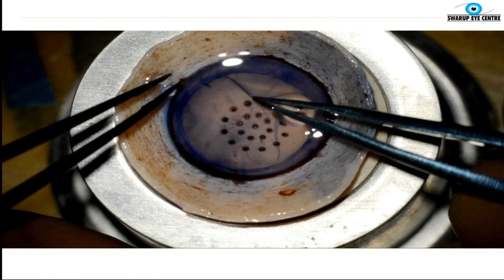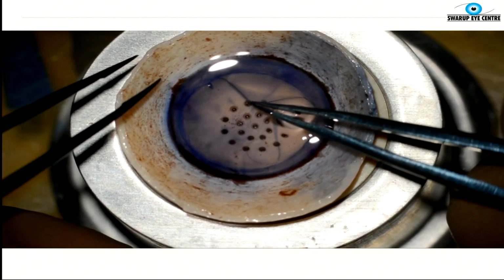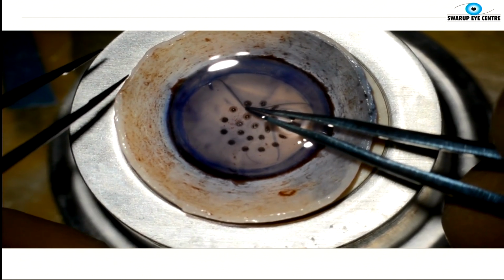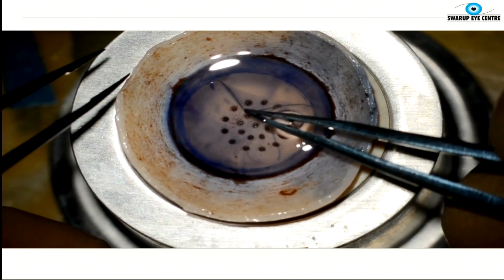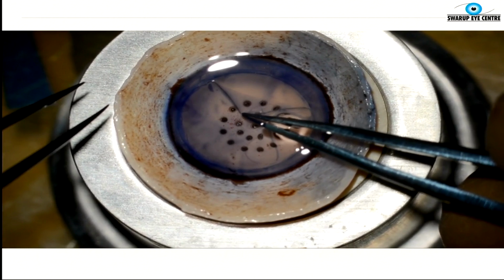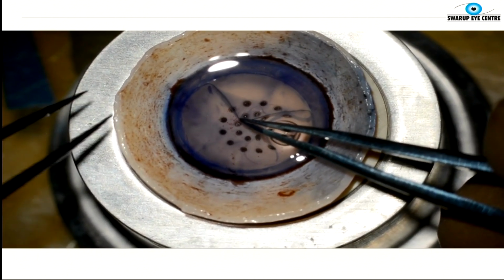And you basically do this stripping under fluid so that the surface tension is reduced, something like the SCUBA technique. And basically, you can use 1 or 2 hands. You have to strip slowly and keep an eye on this line. This should always be straight. If at some point that line is getting kinked, that means there is an adhesion between the Descemet's membrane and the Dua's layer. And it's at that point that it can tear.